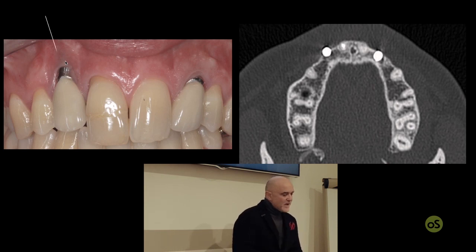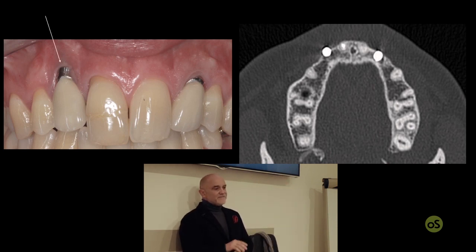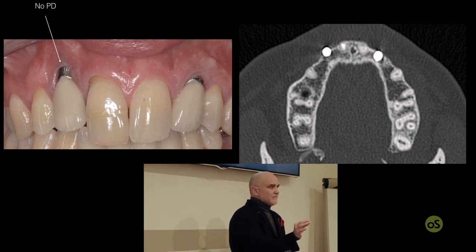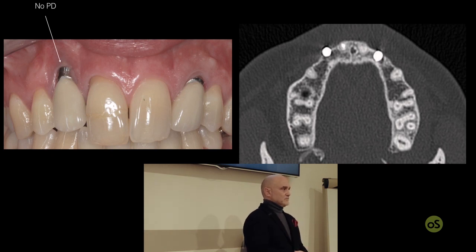So the best way to understand if the implant surface exposed from the bone is also contaminated is by probing it. And when you use a periodontal probe and try to probe the soft tissue margin, you don't penetrate at all if there is still good integration.